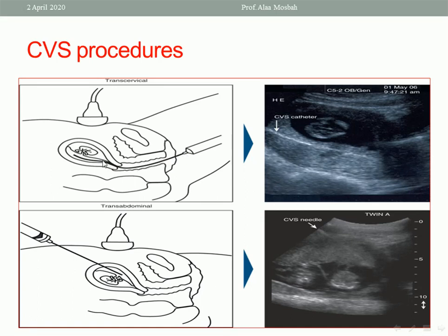In transcervical CVS, the catheter is introduced through the cervical canal, guided by ultrasound, to reach the chorionic villi and take a tissue sample — as shown in the ultrasound image with the catheter visible entering the uterus through the cervix. In transabdominal CVS, the needle passes through the anterior abdominal wall to the chorionic villi to take the sample, also guided by ultrasound, as seen in the ultrasound picture.